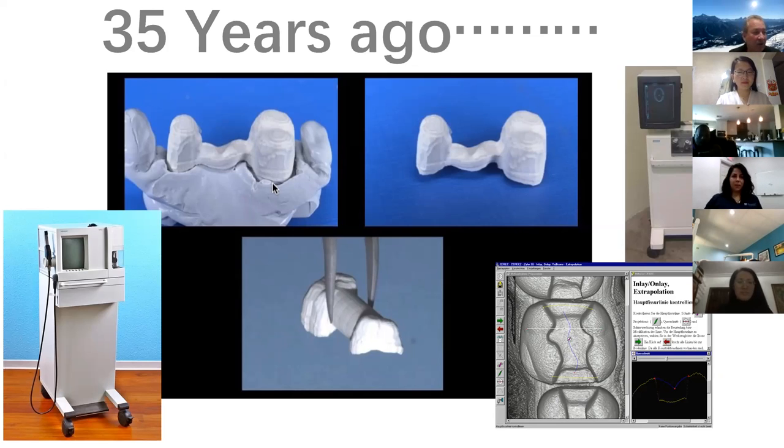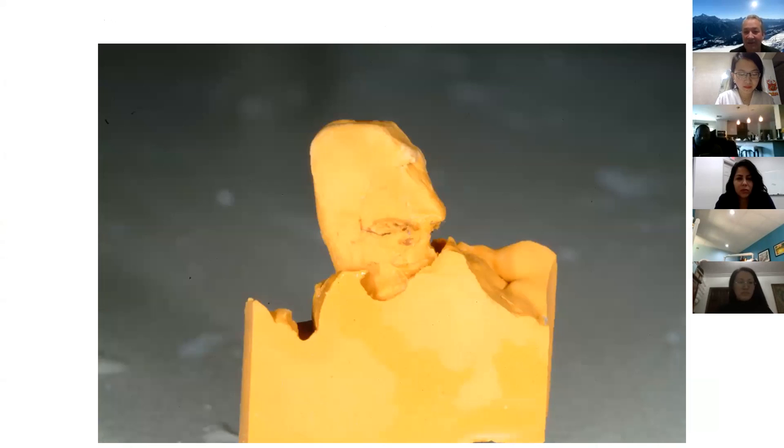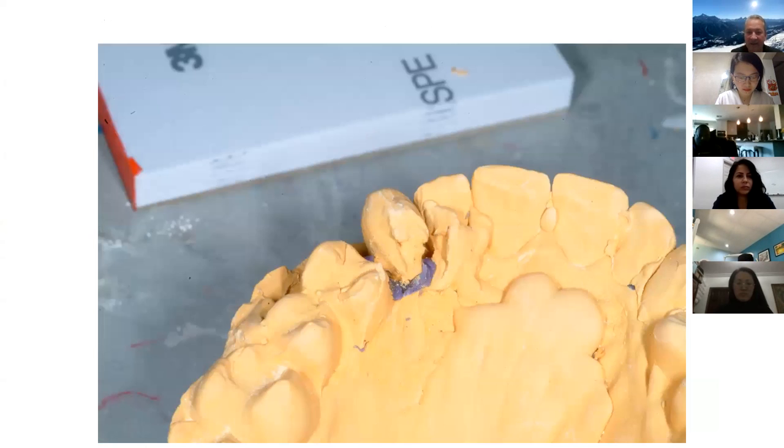The problem which we all have nowadays in conventional work, it doesn't matter if it's a dentist or a lab, is that this kind of stuff happens. I always say artist unknown, because maybe the prep was good, but the impression was bad. Things like this happen, and that means you have to call the dentist and tell him, look, you need to make a new impression. And they say, I can't get the patient to come back again, fix it, try to find the margin yourself.